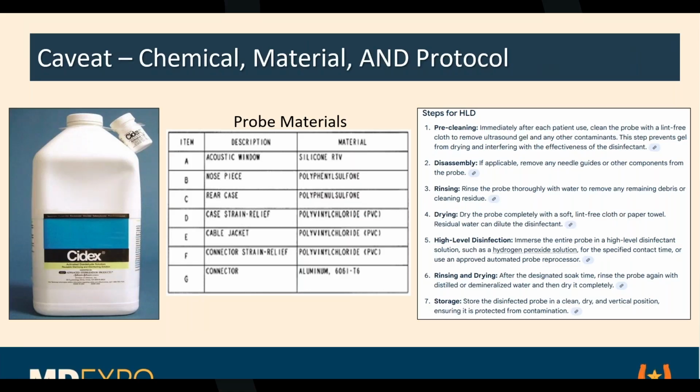Okay, and that's what you should always ask your third-party provider. Are you using materials that are substantially equivalent to the OEM? Yes or no? It's an easy question. If they say it's superior to it, now you know they're lying. Okay, so that's making a claim. But substantial equivalence, they can make that claim.